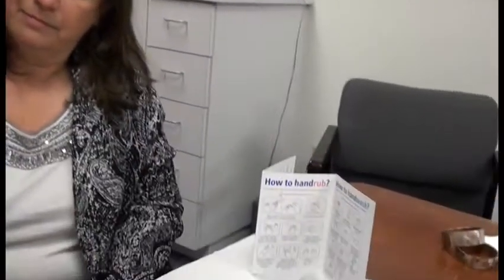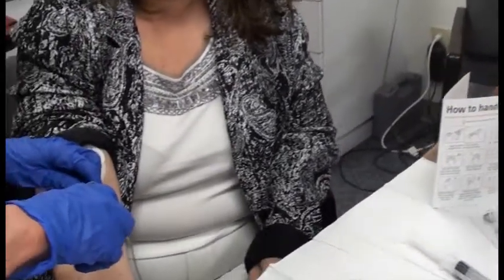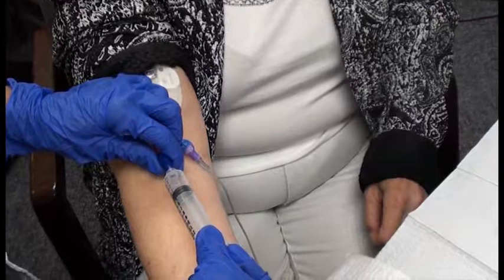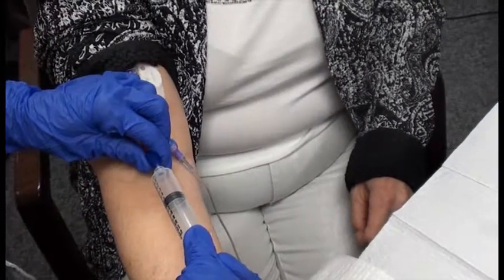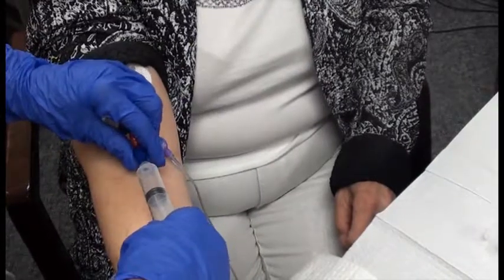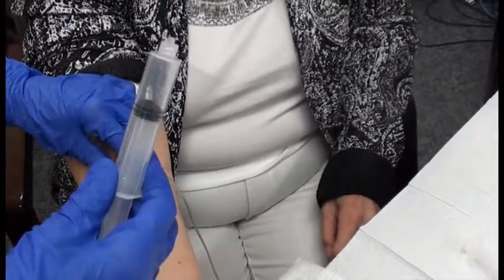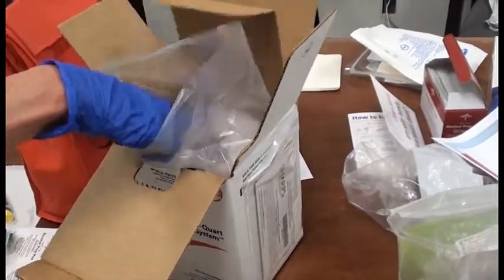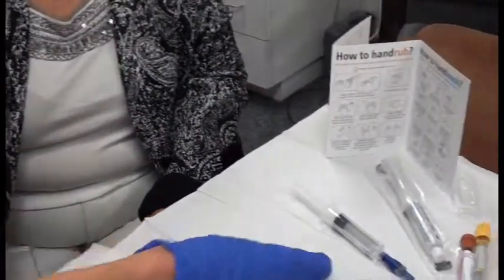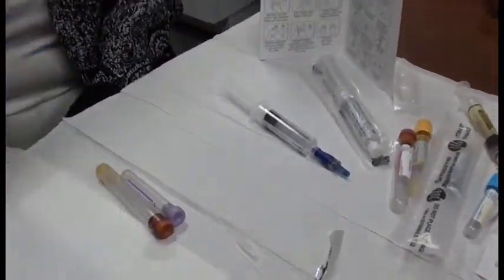Alright, so we have our 5 mLs of waste. So we're drawing back. There is blood in here. Clear blood, but blood nonetheless. And that 5 mLs of blood goes directly into your biohazard container. You don't want it laying around for the dog to get or to flush into the toilet or any of that. Just go straight in the biohazard, done. Then you have your syringe for drawing blood.